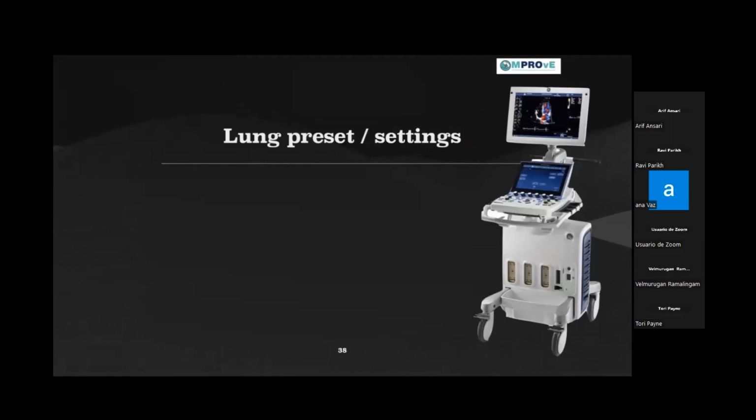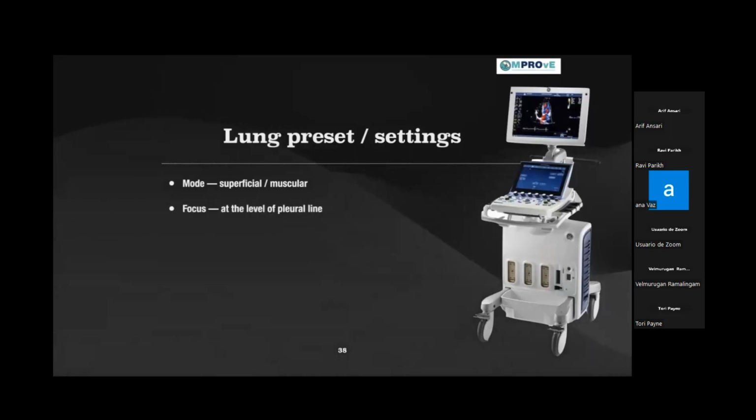Okay, so we've seen some signs, some artifacts now. So just to talk a little bit about the lung preset and the settings, I'm sure Alok must have spoken about it, or he will speak about it, multiple times. It's a slight repetition, but just bear with me. It will consolidate whatever you have learned so far.